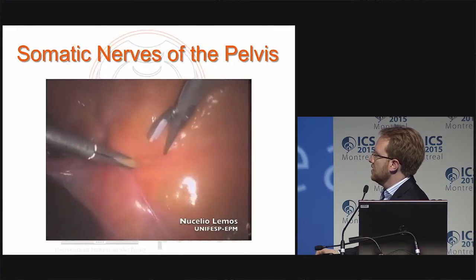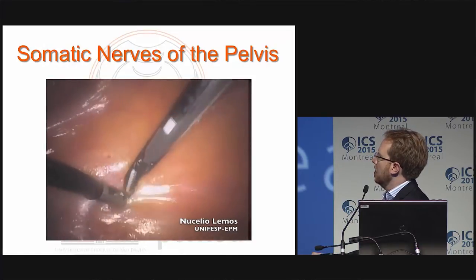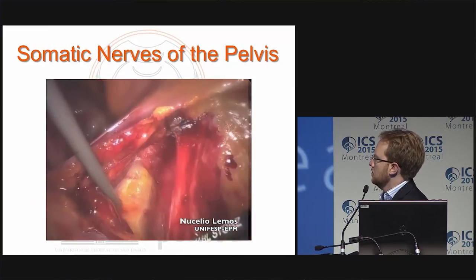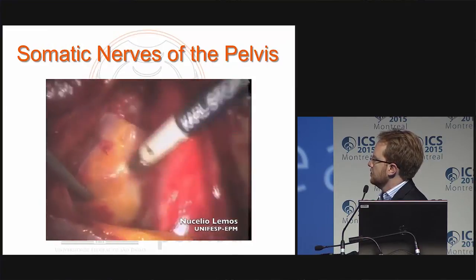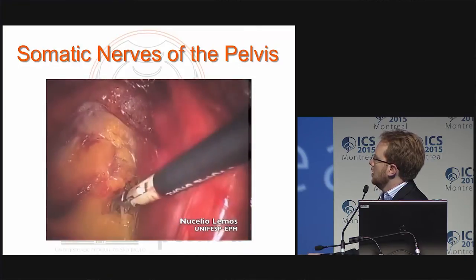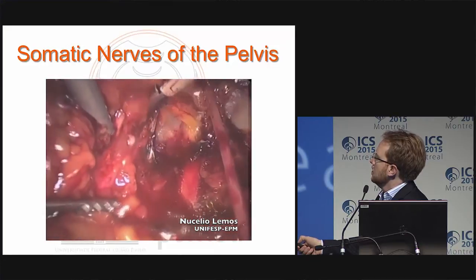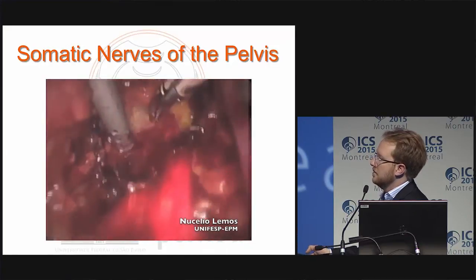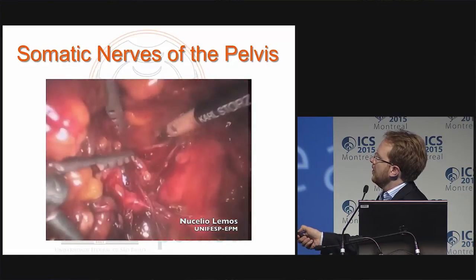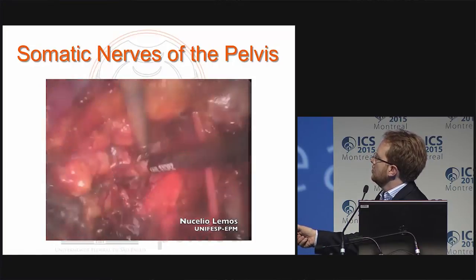These are the external iliac vessels. I'm opening the obturator space as if I was going to do a lymphadenectomy. This is the genitofemoralis nerve, the obturator nerve, the lumbosacral trunk, and the sciatic nerve. This is the endopelvic fascia, the pubocervical fascia, the white line here, and the ischial spine.